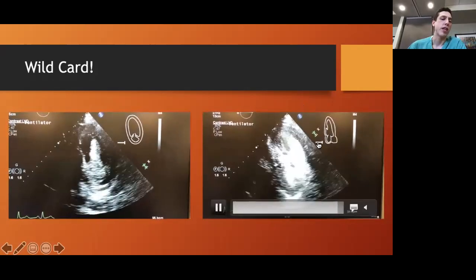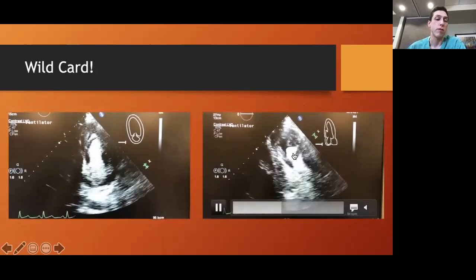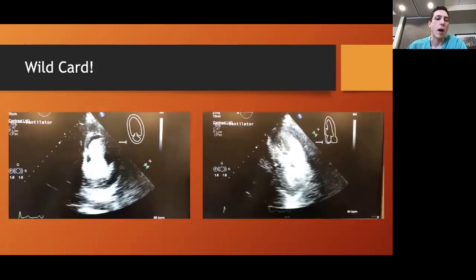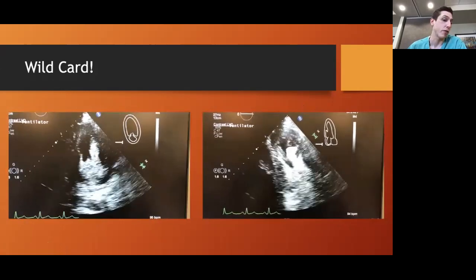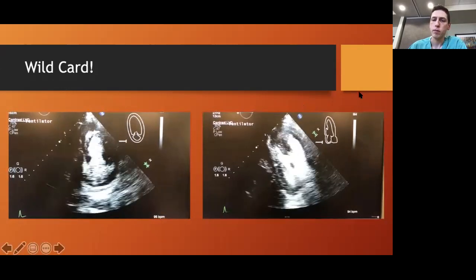Our suspicion is that this patient has a stress-induced cardiomyopathy from his severe reperfusion injury from this detorsed volvulus. And this thrombus is likely forming due to the stasis of blood in the LV, and hopefully will clear itself as his contractility improves.